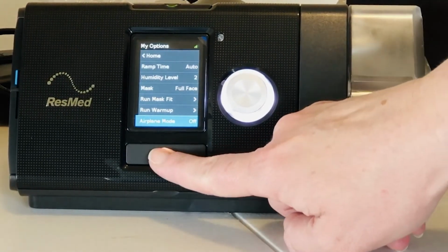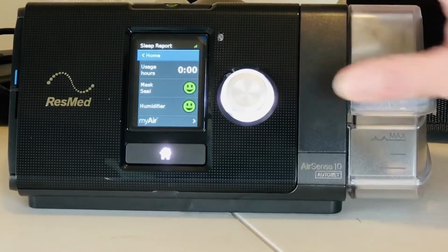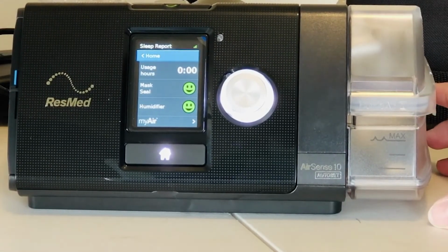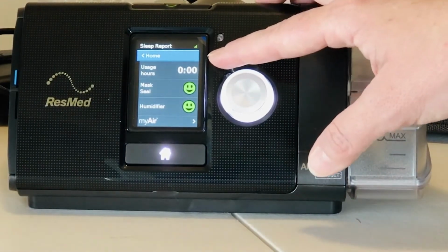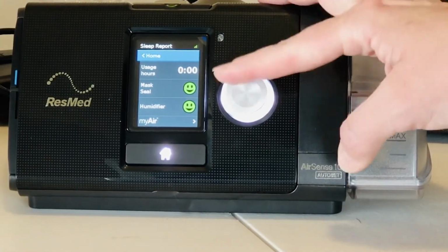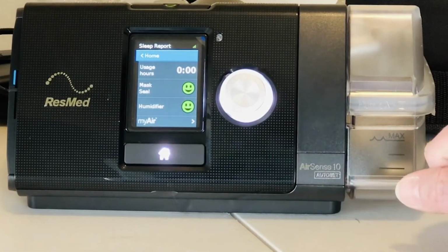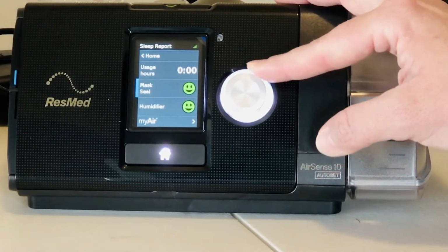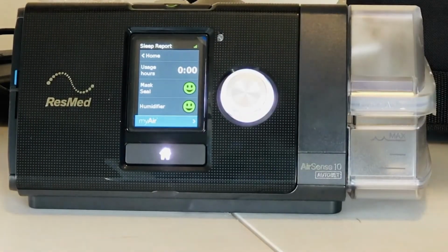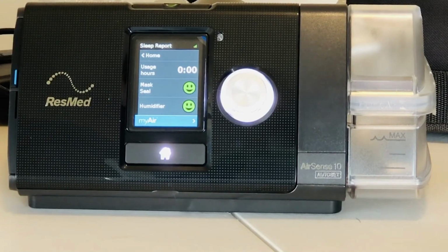I am going to return to the home menu and select Sleep Report. This is the default screen you will see once you shut CPAP off every day. It will tell you how long you used the machine, if your mask was sealing, and if the humidifier was functioning. The green smiley faces are good, and if these appear red and frowny, you must troubleshoot. It is also reminding you to set up the My Air account offered by the manufacturer ResMed for more details about your sleep.